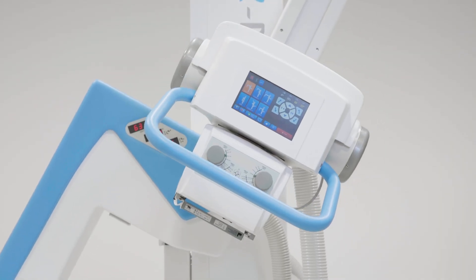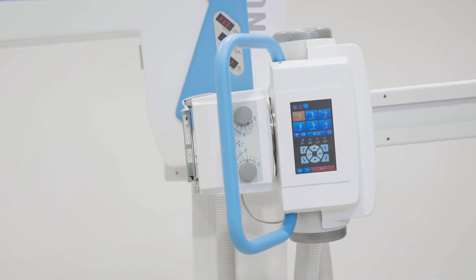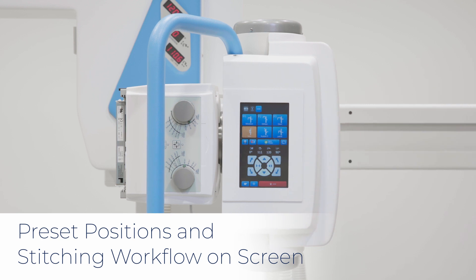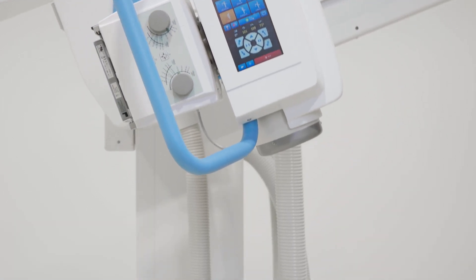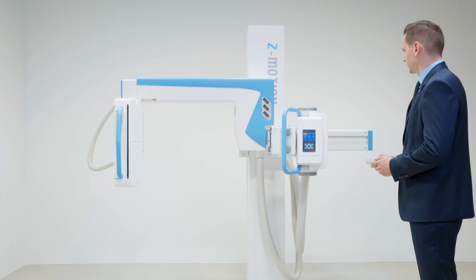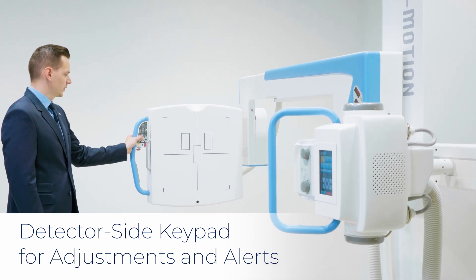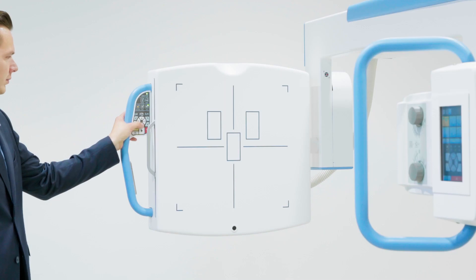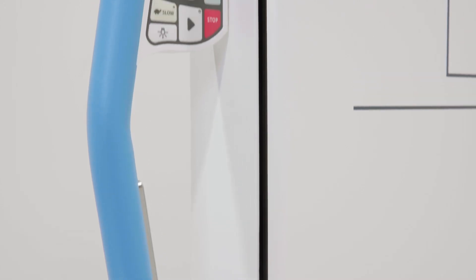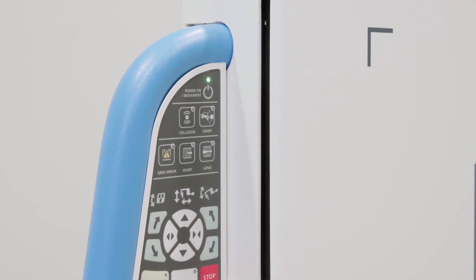The touchscreen console of the Z-Motion conveniently shifts from portrait to landscape mode as the arm rotates. Preset positions and the stitching workflow can easily be activated using the touchscreen. The console is complemented by a wireless remote control which fully operates the stand. A detector side keypad facilitates positioning at patient side, such as detector height adjustment for chest exposures. The keypad also provides X-ray grid status feedback and system warning signals.